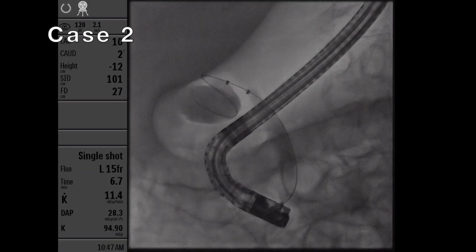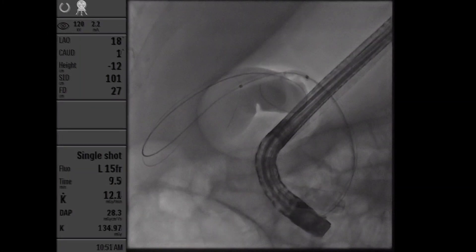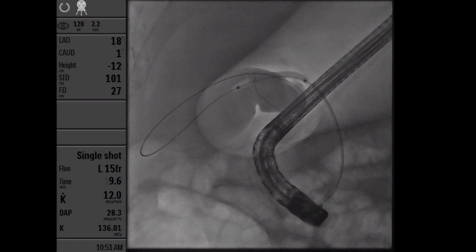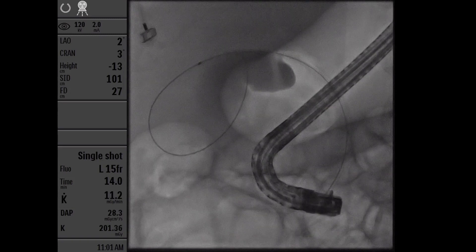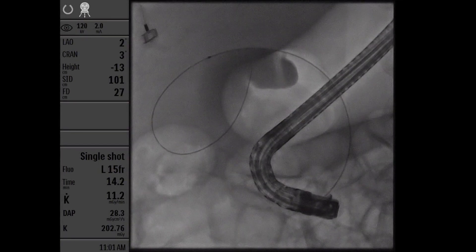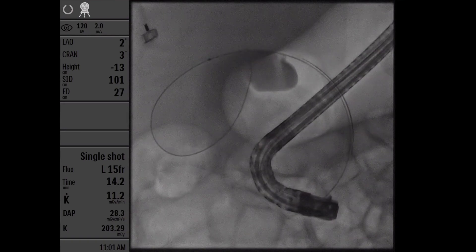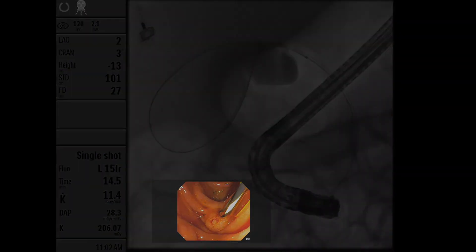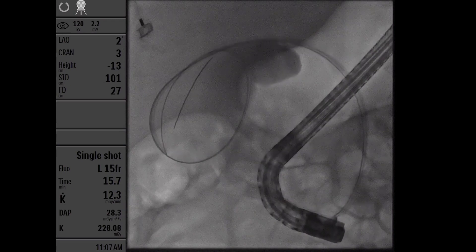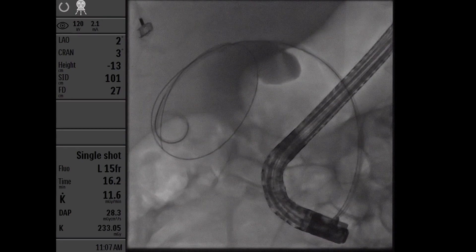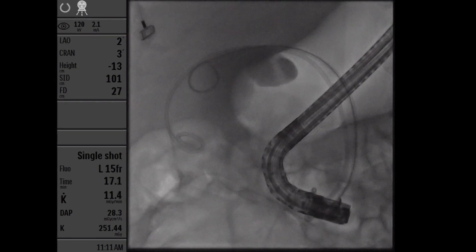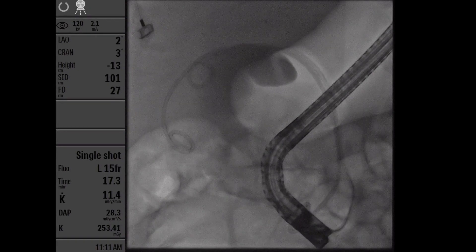The final fluoroscopic image is shown here. In this case, access to the gallbladder was obtained in a similar fashion. However, instead of deploying a single stent and re-accessing the gallbladder, a cytology brush catheter was advanced over the initial wire and into the gallbladder. The brush could then be removed, then a second wire coiled into the gallbladder so that it now harbored two wires extending across the major papilla. The first plastic pigtail stent can then be advanced and deployed over the initial wire, with the second stent quickly advanced and deployed over the remaining wire, allowing for dual gallbladder drainage without having to re-access the cystic duct.